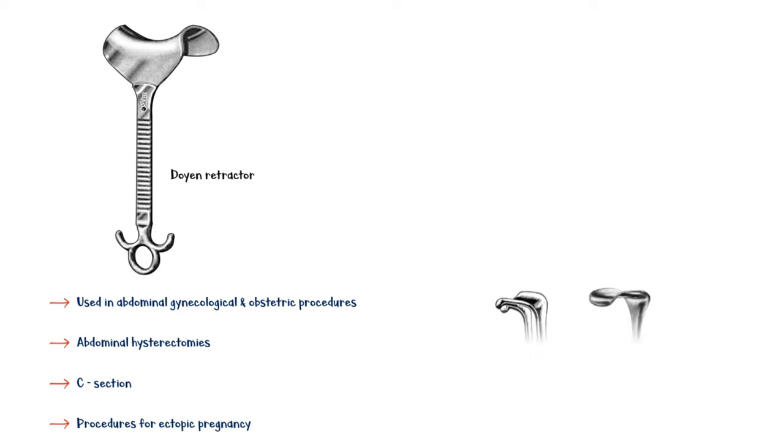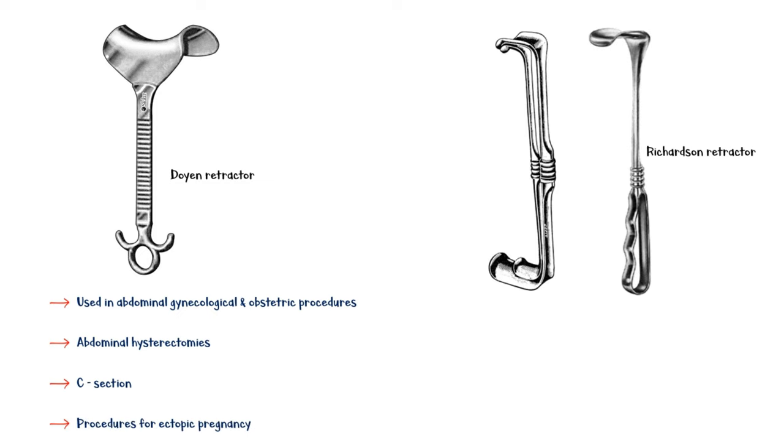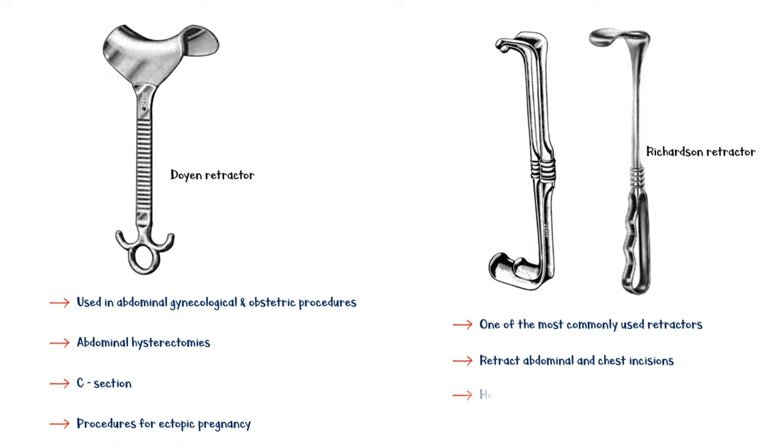Richardson retractor, one of the most commonly used retractors in general surgery, is used for retracting abdominal and chest incisions. It can hold back multiple layers of deep tissue.